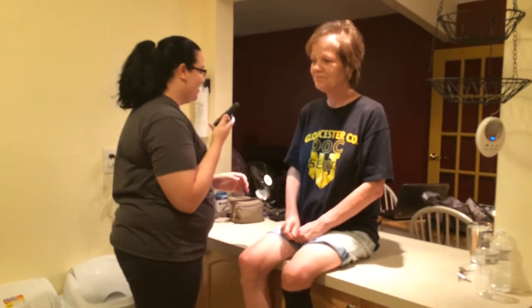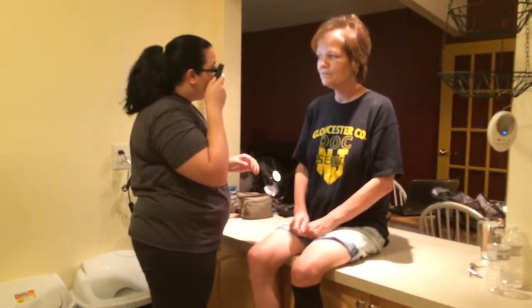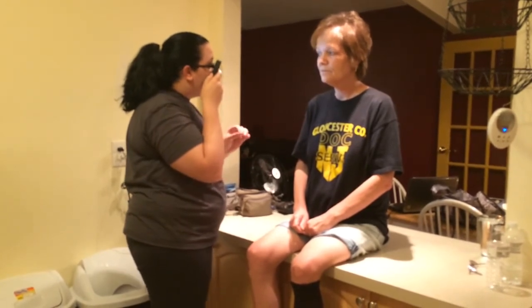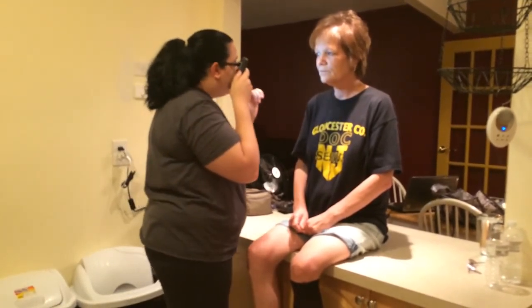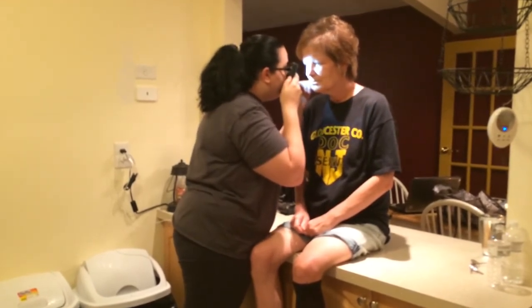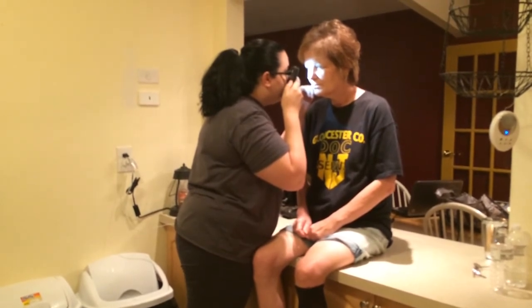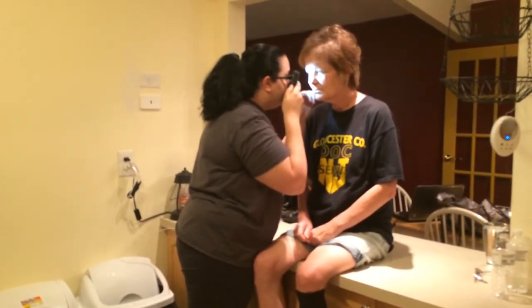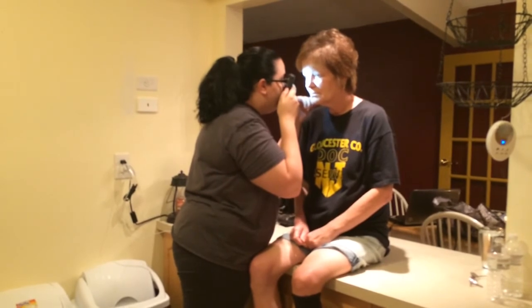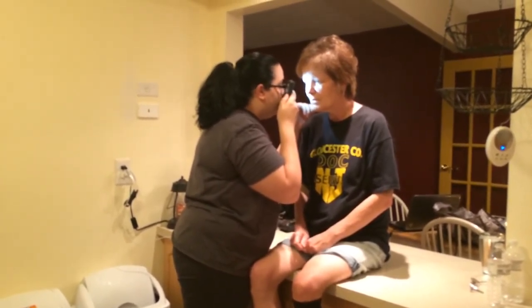I know. So what I'm going to do is I would hold it to my eye, look into your eye, look for the red reflex, and move forward once I find it, very close. And then once I get close enough, I can then look at the internal blood vessels and the optic disc and all the internal structures. Again, checking for any abnormal signs like swelling, redness, tenderness to light, or photophobia.